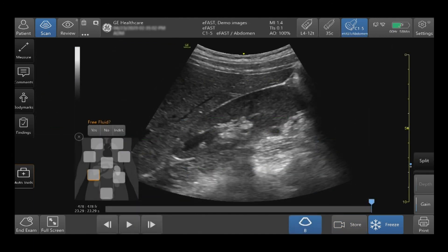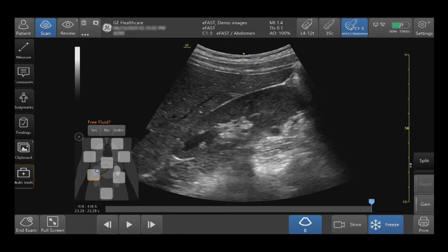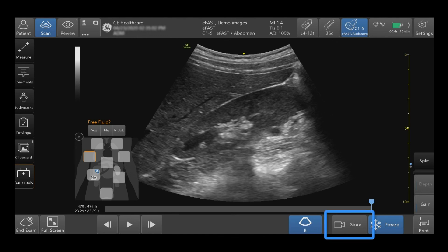In order to use the eFAST tool, select the correct probe and preset. In this case, the C1-5 and the eFAST abdominal preset will be used. Tap Store and that image will be stored and placed into the selected location of the diagram. At this time, you can select if free fluid was seen or not by tapping Yes, No, or Indeterminate. In this case, I will tap No. I will then select Store on my touch screen and that image will now be stored.